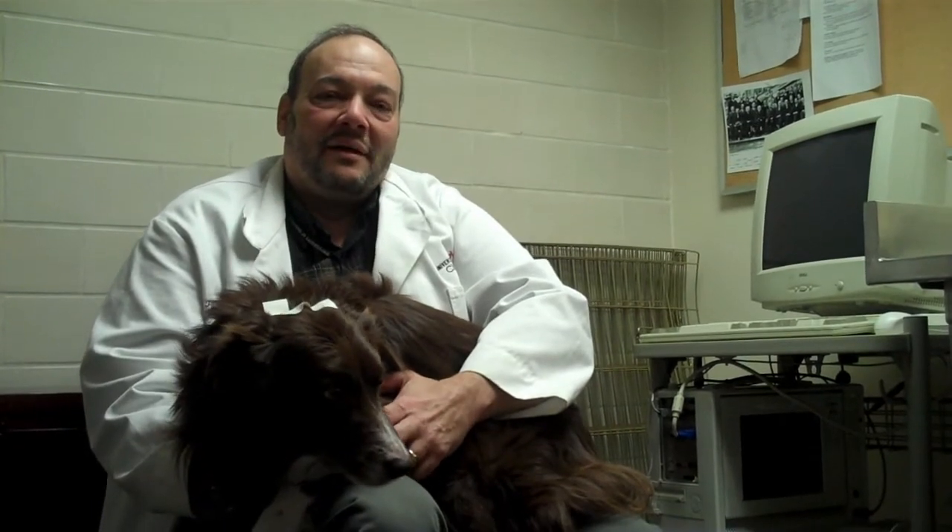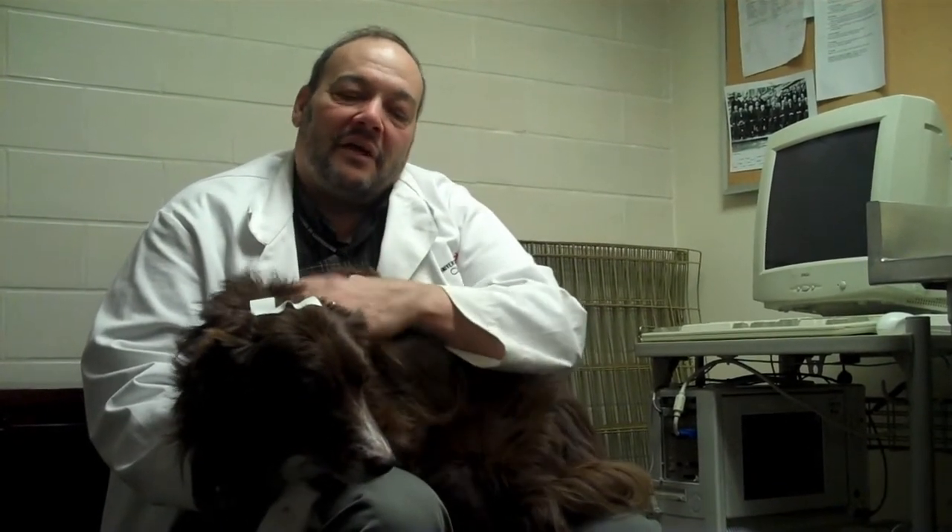Hi, I'm Dr. Pete Scheifele at the University of Cincinnati's Fetch Lab. Today we're going to be running a hearing test on this Border Collie Q, and when getting ready for the hearing test, there are a number of things that we have to do.